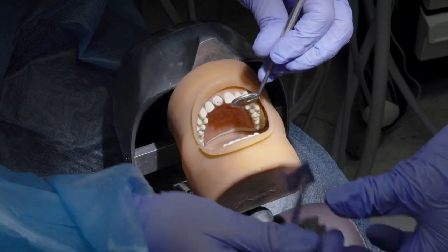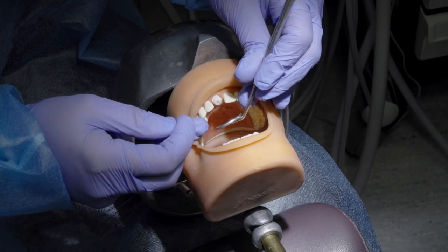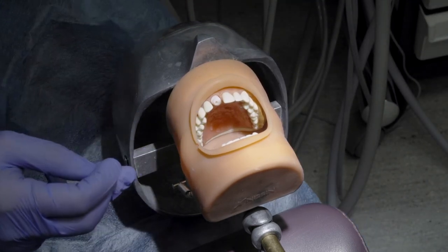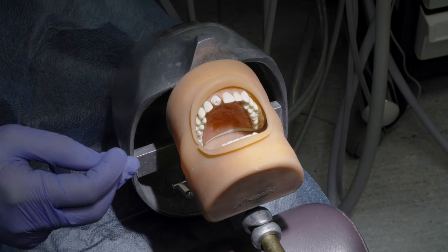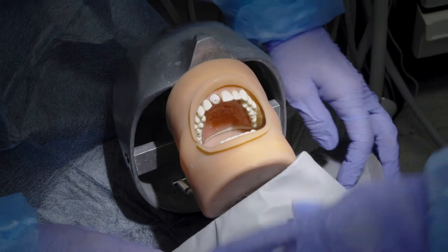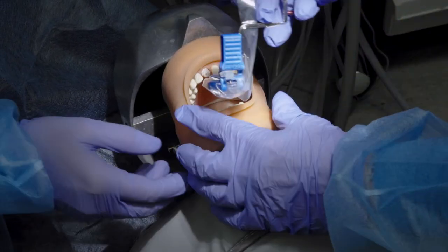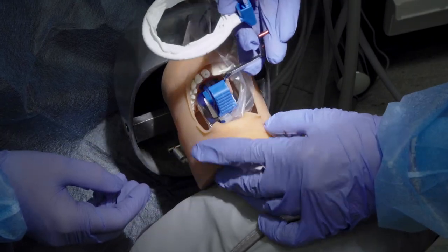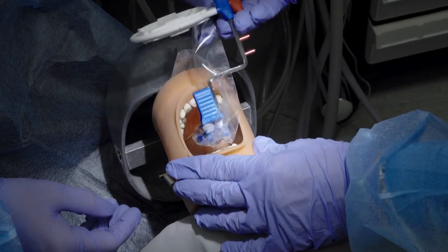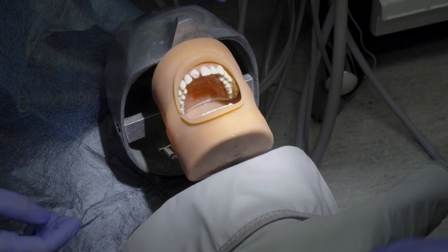Everything looks fine. The assistant will now prepare to take the final image. And this will determine if the root canal is successful and everything is sealed.